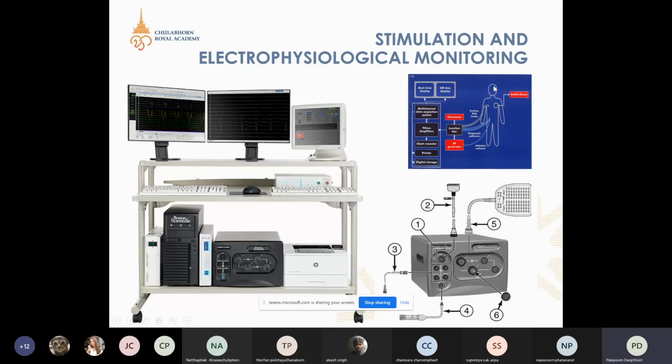After the patient is prepared with the defibrillation patch placed on the body, all of the EKG surface patches attached to the body already, and the ground patch as well, all of these things will be connected to the amplifier.